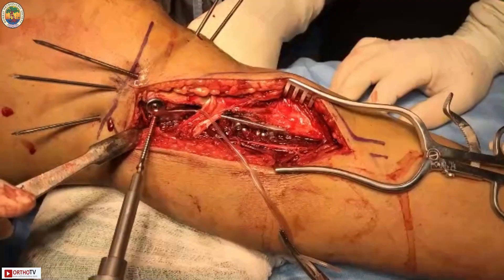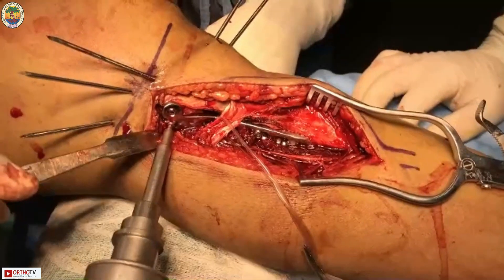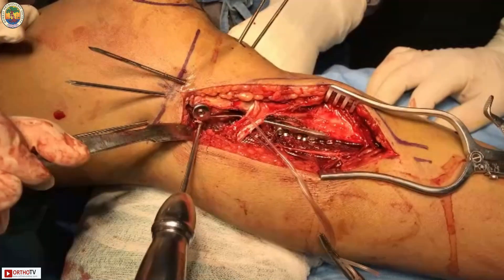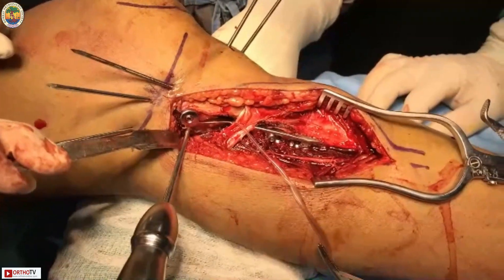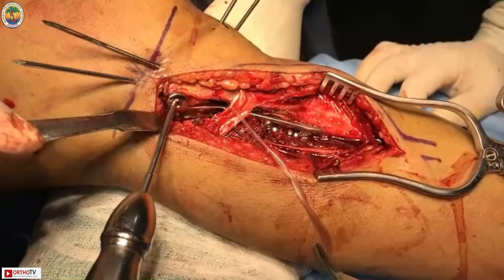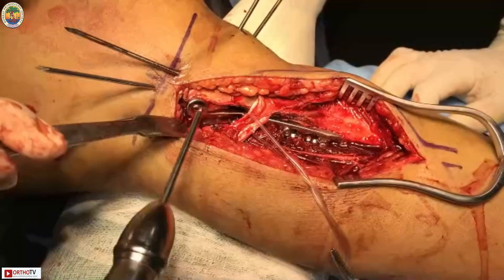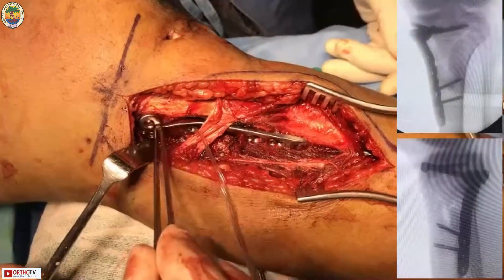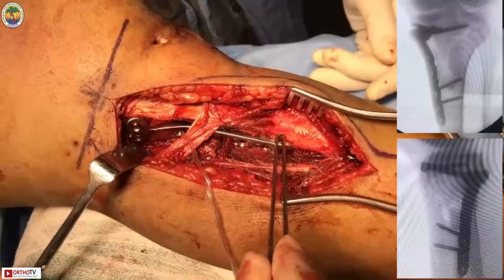Cancellous locking screws are placed in the proximal fragment. Only the two middle screws are placed because placing more screws on the lateral side would also hold the lateral fracture and make it difficult to reduce the lateral fragment later. The plate is thus fixed with only two screws, holding the posterior medial fragment proximally and the distal fragment below.